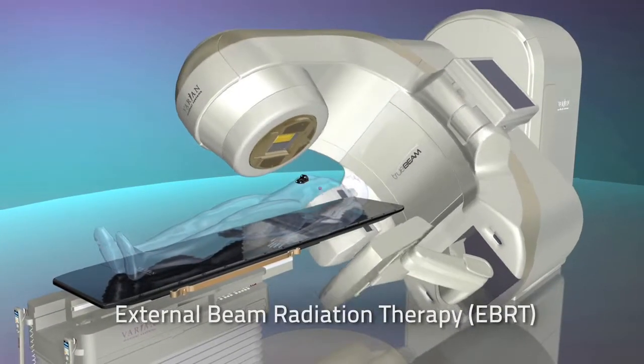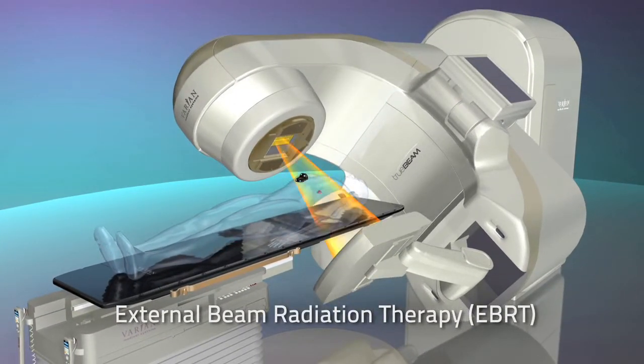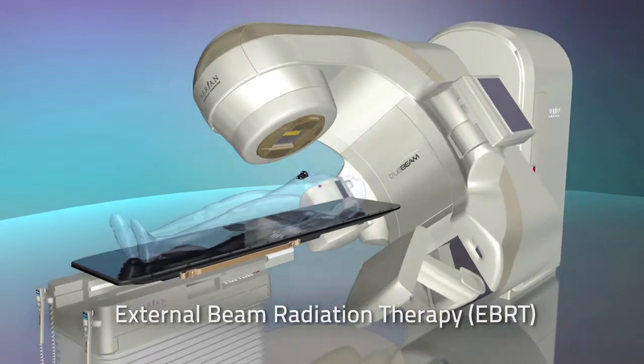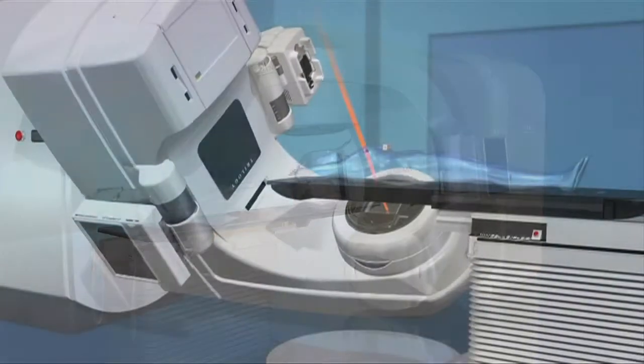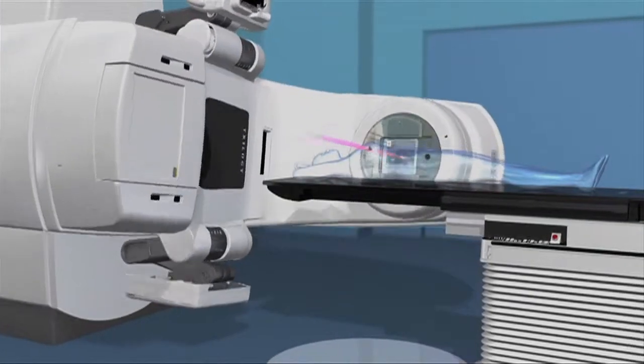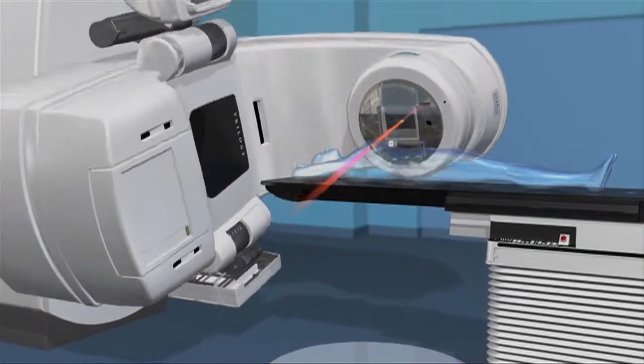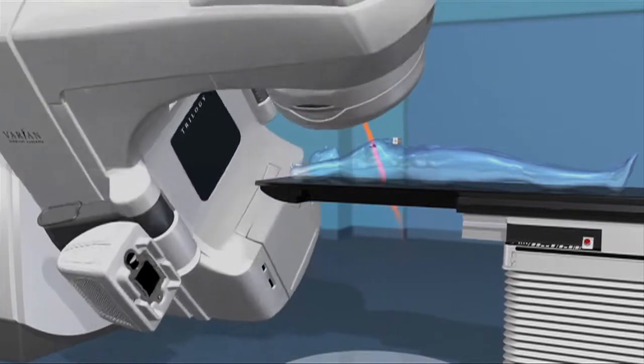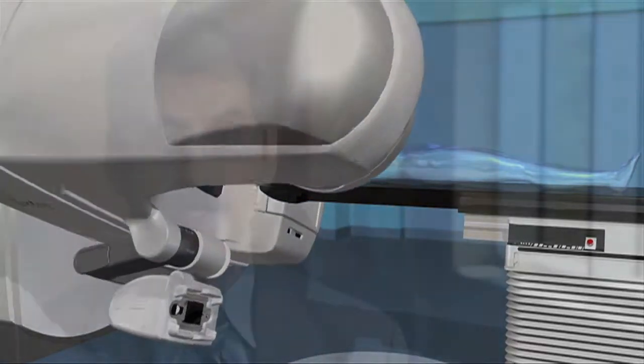External beam radiation therapy, or EBRT, is the most common form of radiation used to treat tumors. Today's state-of-the-art EBRT systems, known as linear accelerators, deliver the most advanced radiation therapy in the world. External beam radiation therapy uses x-rays that are highly focused at the tumor to treat the cancer from the outside.